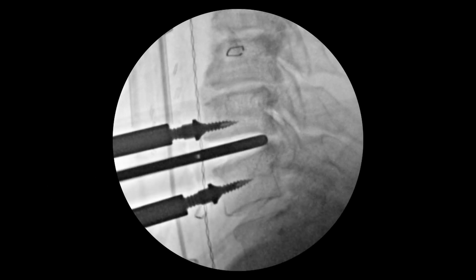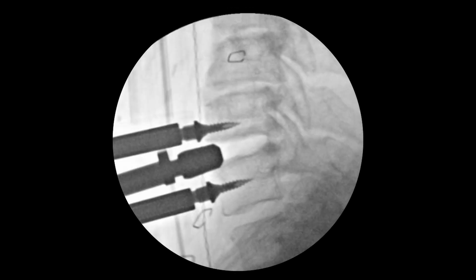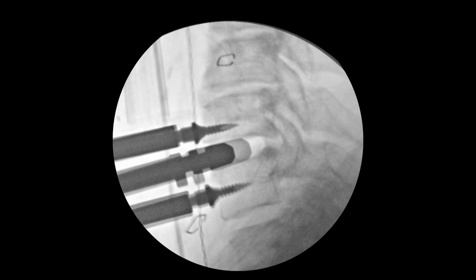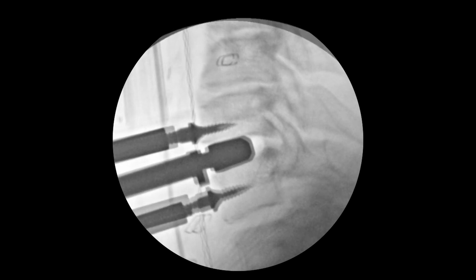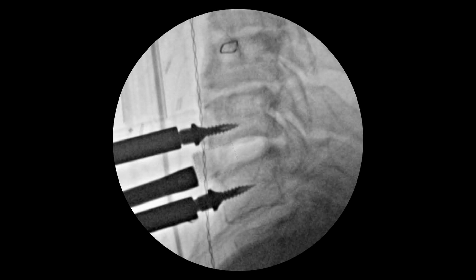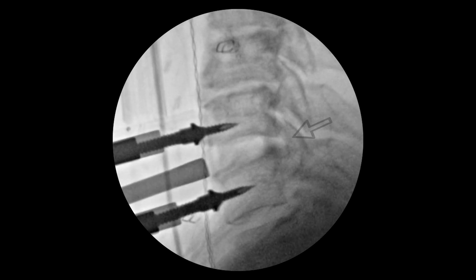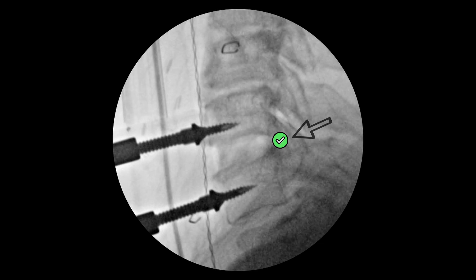After removing the degenerated disc, I used a special instrument called the Kerrison to remove the bone spurs to unpinch the C7 nerve right here. Next, I used a special sizing tool called a trial to see how big this disc space is. Then I took a small piece of bone from the patient's hip and gently tamped it into the disc space to keep the bones apart, so that the nerve right here does not get pinched again.